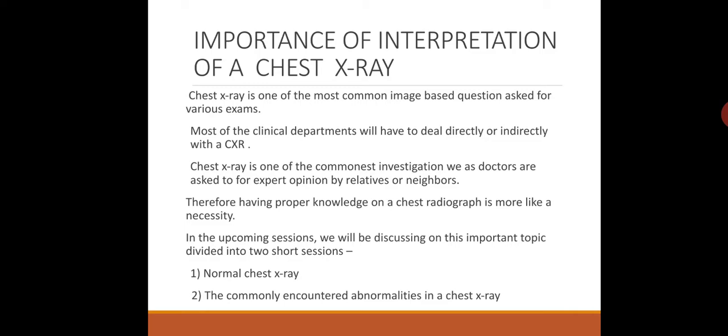So for the students who are going to appear for various entrance exams, you can expect some image-based questions from the chest X-ray. So reading an X-ray is equally important academically and clinically.